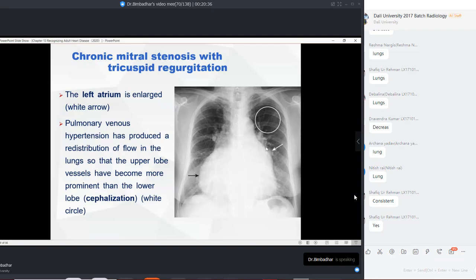As a result, since the pulmonary venous wedge pressure has increased, the pulmonary blood vessels inside the left upper lobes are prominent. They become wider because they start filling up with blood, right? The first branch of the left pulmonary artery is the upper lobar branch itself, and we also came to know that this is running posteriorly to the pulmonary artery and bronchus here.